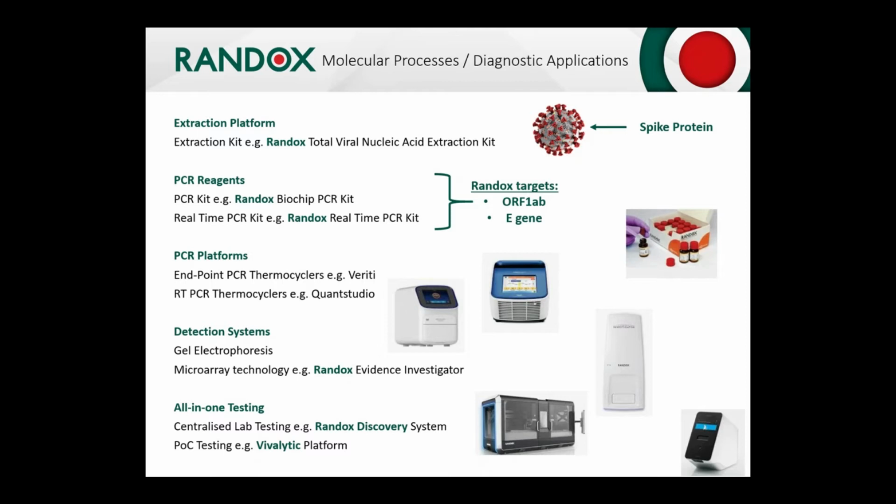Okay. All right. Just on the instruments again, what you were saying: your lab is traditionally split up into extraction, PCR, and detection. That's how the lab operated. But in the future, there are a lot of all-in-one testing solutions coming on the market. Where do you see the future for these types of devices?